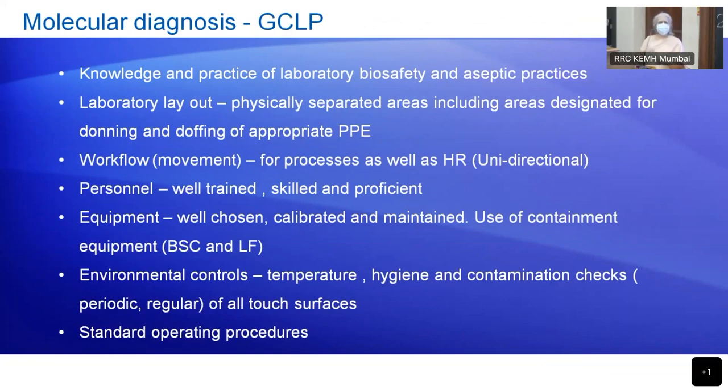You don't necessarily have to put in one PCR reaction for the first swab. You can hold the samples, and then go back and find out whether any of those were contaminated. This is an activity that should be done periodically but regularly. We do it once a month in our labs because there's not much contamination, but if you face a problem and are forced to do a decontamination routine, then you must do it following that, and check that your measures are followed.